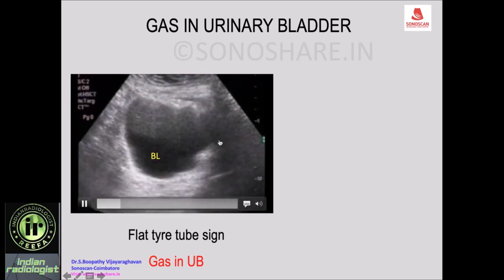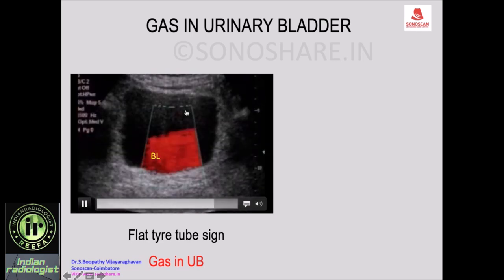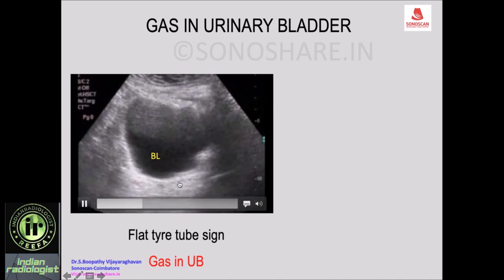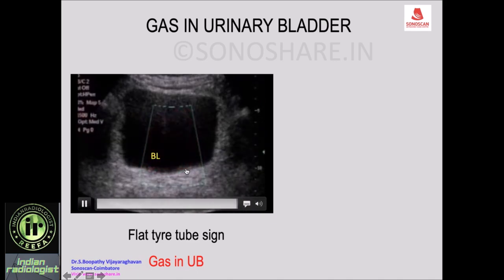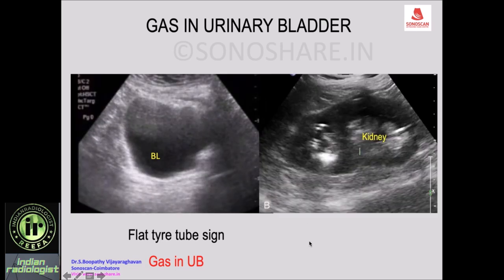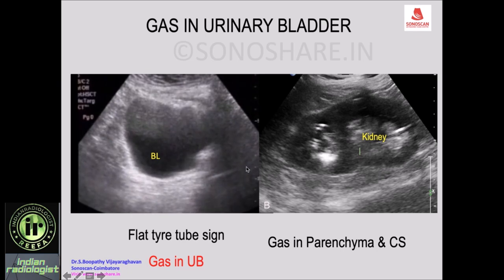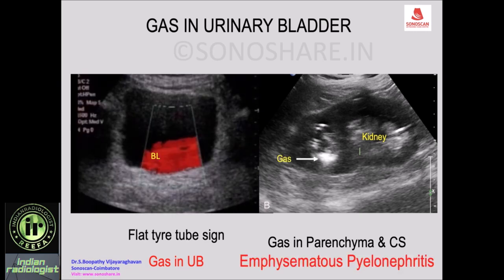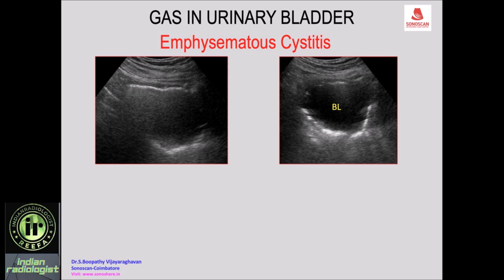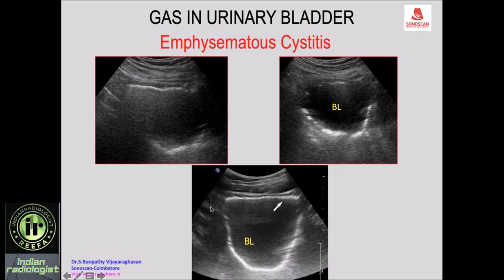Another patient with urinary tract infection: gas in the bladder with the explosion sign and the flat tire tube sign — gas bubbles escaping from the left ureteric orifice. Looking at the kidney, there is gas in the parenchyma and collecting system — emphysematous pyelonephritis — with escaping gas from the kidney into the urinary bladder presenting as the flat tire tube sign. This is acute emphysematous pyelonephritis with gas in the urinary bladder. Emphysematous cystitis with the dipping technique shows gas persisting all along the entire wall of the urinary bladder — very typical in a patient with diabetes mellitus.